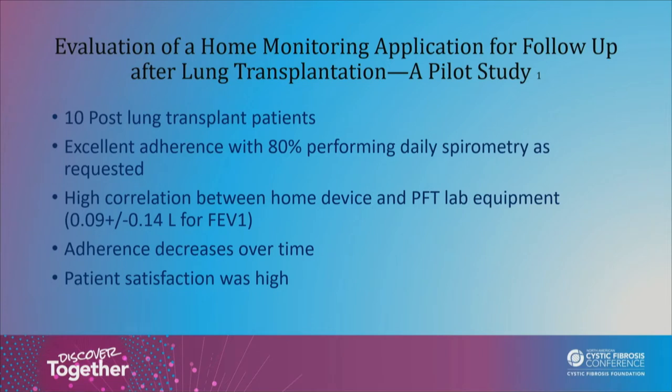And there was a high correlation between lab spirometry and home spirometry. The ATS standards for repeatability are 150 cc's in the FEV1, plus or minus, and their results matched that repeatability requirement. One thing to notice is that adherence did decrease with these patients over time. Only 10 patients, so if you lose one of them, you're going to lose a lot of adherence.